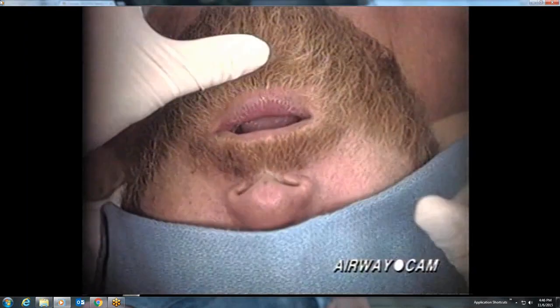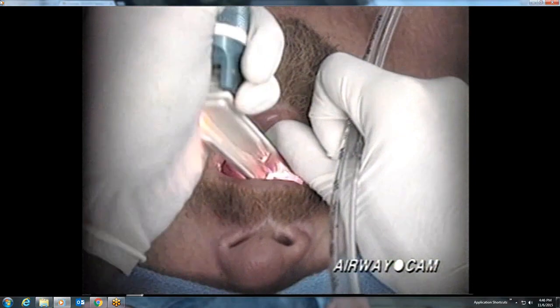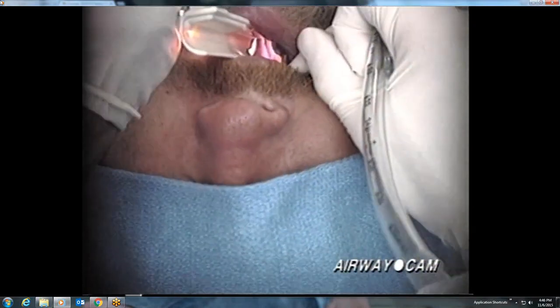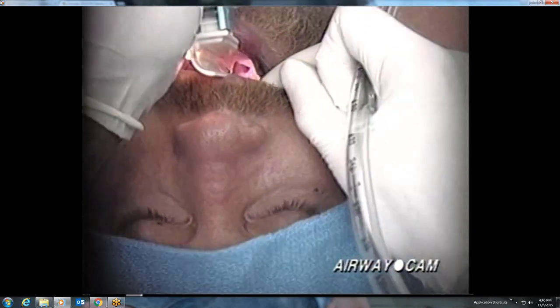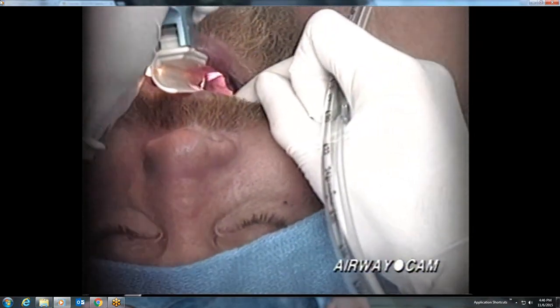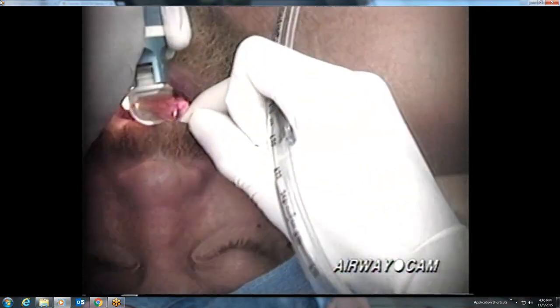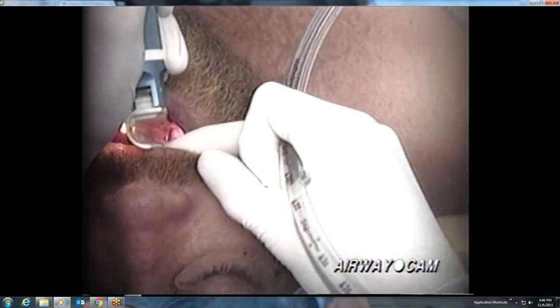This next intubation with a Miller blade shows posterior pharynx, epiglottis, and esophagus as the blade is advanced, withdrawn, and re-advanced in an effort to directly elevate the epiglottis. Unlike the curved blade, the straight blade has no stability along the curvature of the tongue and no natural stopping point, since it is not positioned into the vallecula.